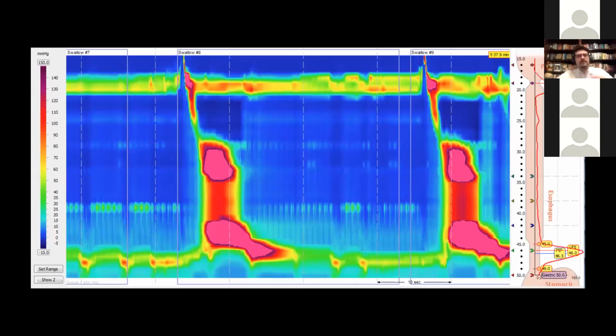So the last type of achalasia, type 3. It kind of looks like type 2, but you don't have the pan-esophageal component. The swallow actually starts semi-normal looking, but then it moves on, and it will develop into this big spasm, hypercontractility at the lower end of the esophagus, coupled with a failure of the LES to relax.